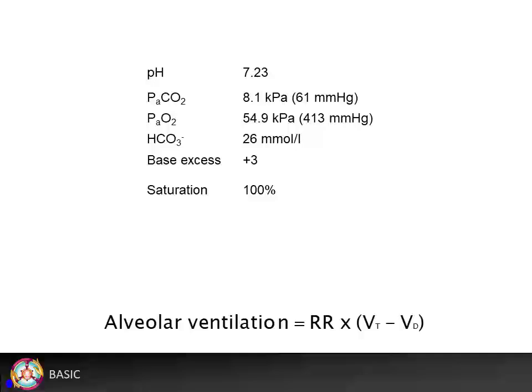So here is the blood gas. What would you do in response? The PaO2 is very high and the oxygen concentration can be reduced. He has a respiratory acidosis with a raised PaCO2 and the alveolar ventilation needs to be increased.